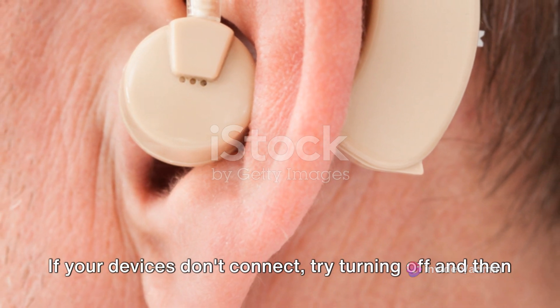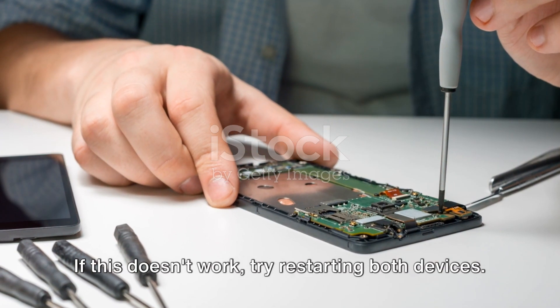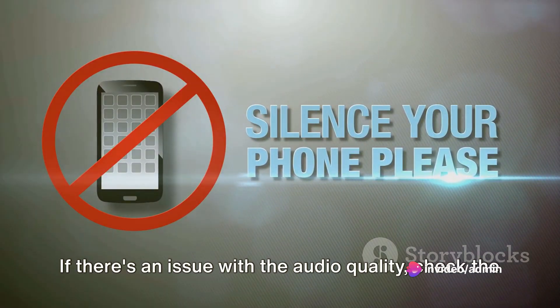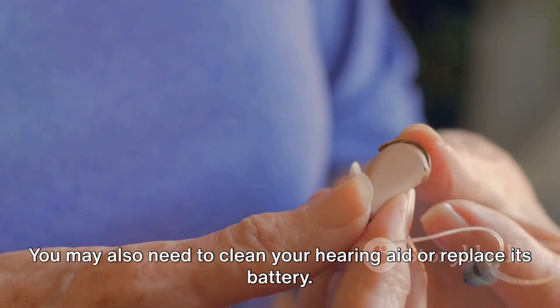If your devices don't connect, try turning off and then turning on the Bluetooth on both devices. If this doesn't work, try restarting both devices. If there's an issue with the audio quality, check the volume and balance settings on your phone. You may also need to clean your hearing aid or replace its battery.